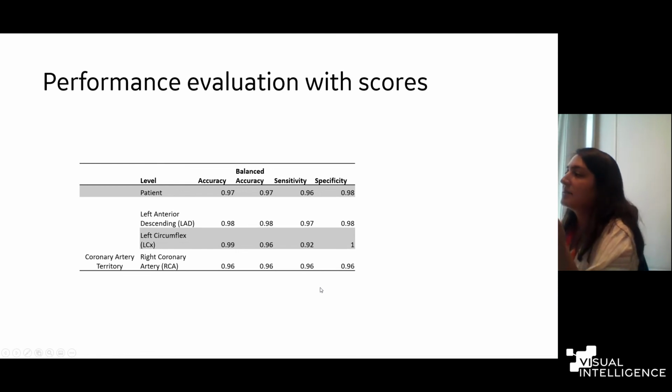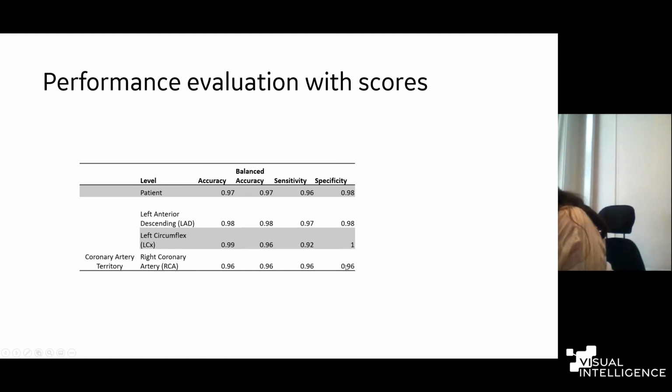And we also looked at the sensitivity and specificity. Sensitivity is, as we know, the recall of the positive class, and the positive class that we consider here is the scar class. So recall of scar is the sensitivity, and recall of no scar is the specificity, if we think about it. In sensitivity, we are interested in how well we can identify the patients with scar, and in specificity, how well we could identify the patients without scar, which looks quite okay.